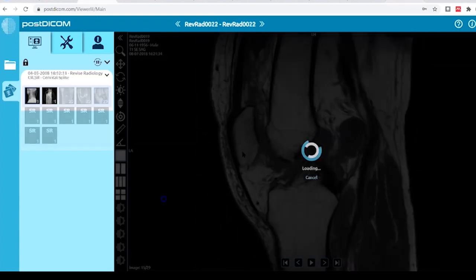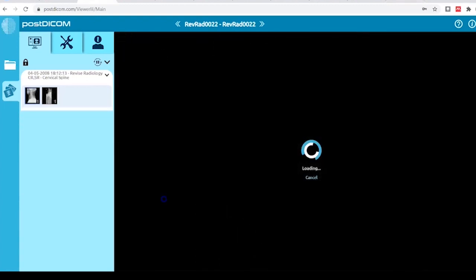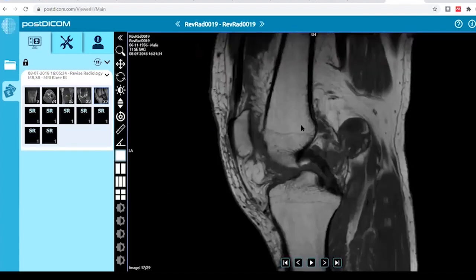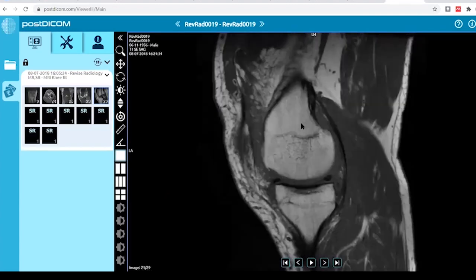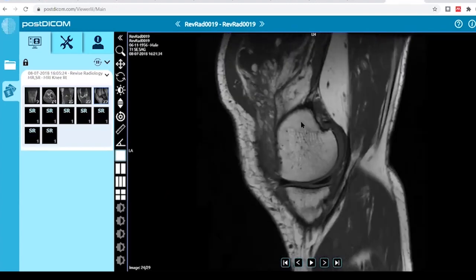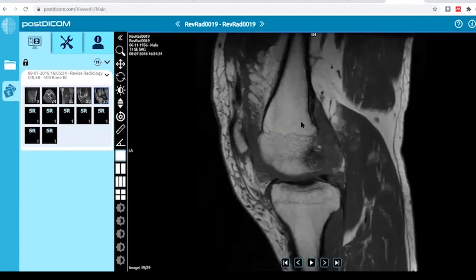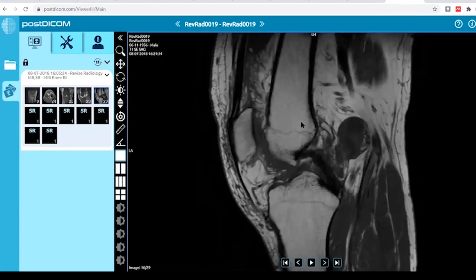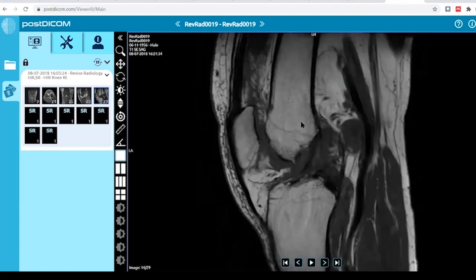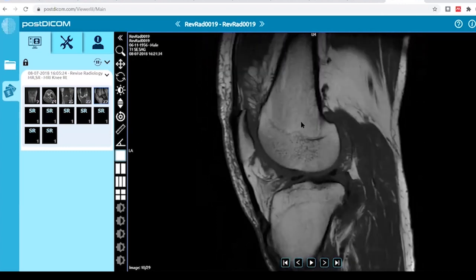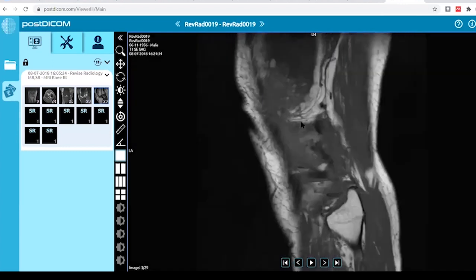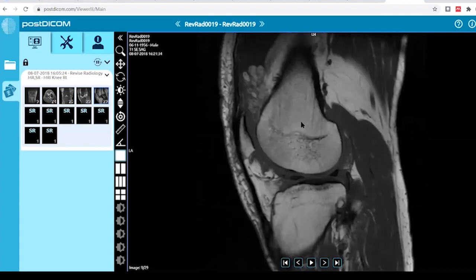Actually, that last sequence was T1, not gradient. It was a T1 sequence. So you can see hyperintense fat globules in the suprapatellar pouch.